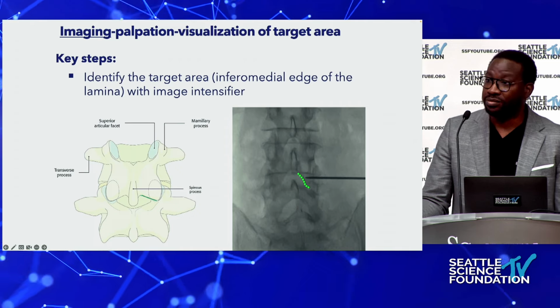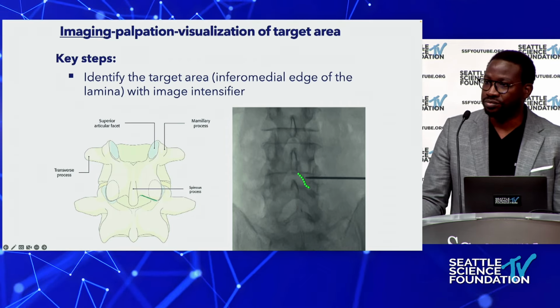And the nice thing too is that you could do that procedure with a tube, but I have a patient where I did one level with the endoscope and one level with the tube, and the radiologist couldn't even read that there was a surgery done at the level done with the endoscope. I think that's the benefit of using an endoscope rather than a tube for these cases: you disrupt the facet joint a lot less. In my experience, it's clear. There was definitely one level done with the tube where the top of the facet joint is messed up and the lateral pars is drilled, and then with the endoscope you can't tell that any bony work was done. So in these cases, if you can safely do it with the endoscope, it is better than doing it with a tube.